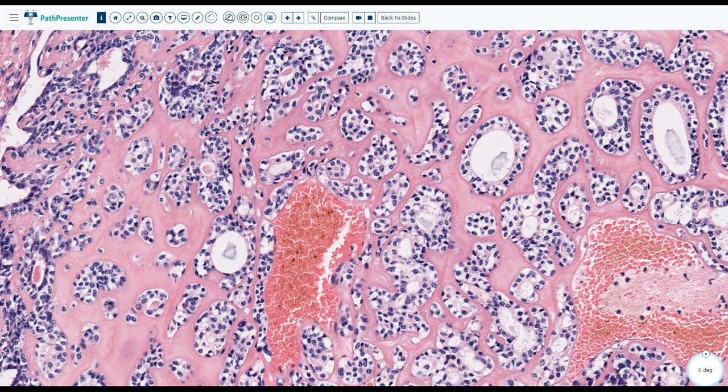What is the word you'd like to use? I want a word like a description, not shooting to the diagnosis. I agree there are some myoepithelial cells, but would you use a descriptive word here?